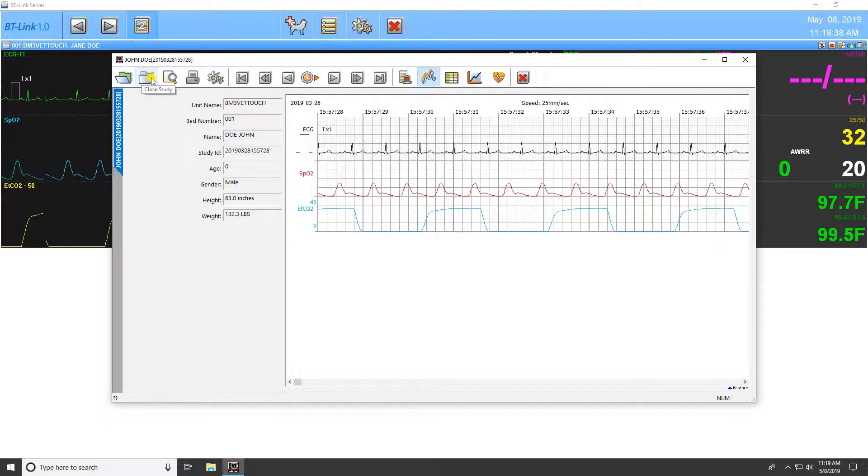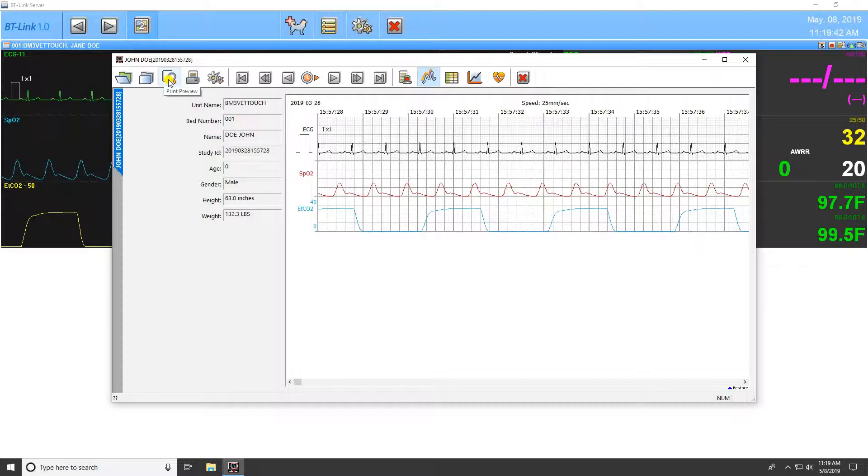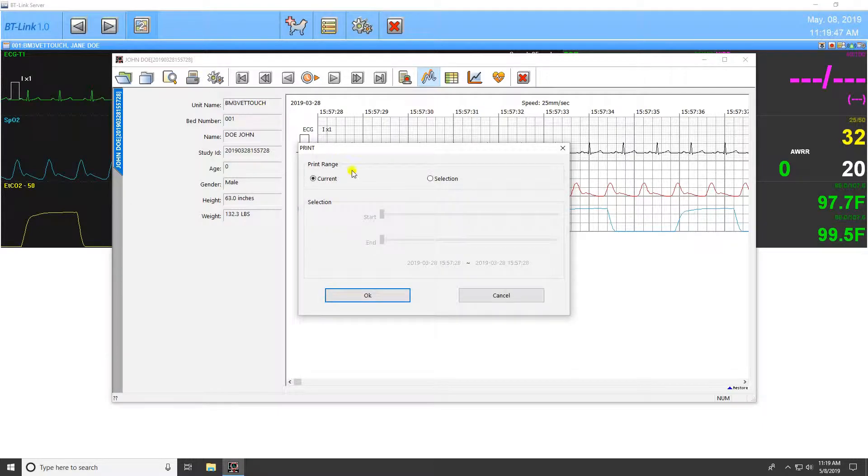The next icon closes the currently selected study. The next icon allows for a print preview of the currently selected study, and the following icon allows you to print the study.